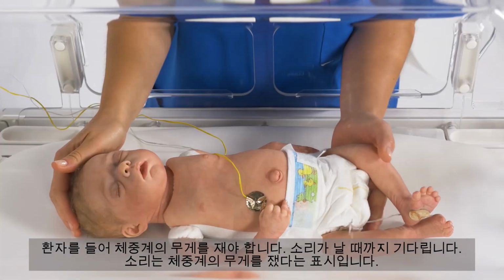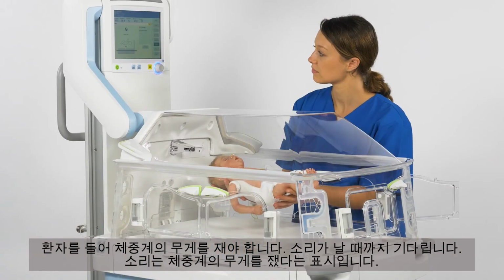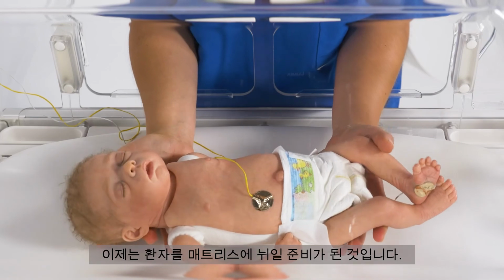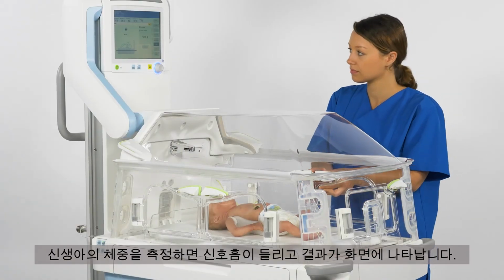You need to tare the scale by lifting the patient up. Wait for a signal to sound, indicating the scale has been tared. You are now ready to place the patient on the mattress. After weighing the infant, you'll hear a signal sound and the result displayed.